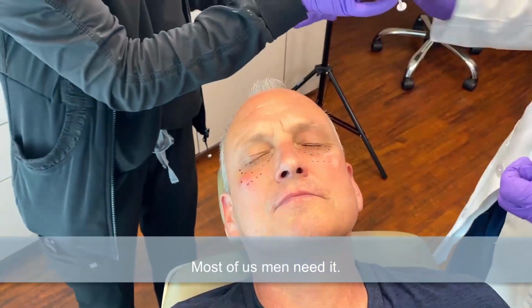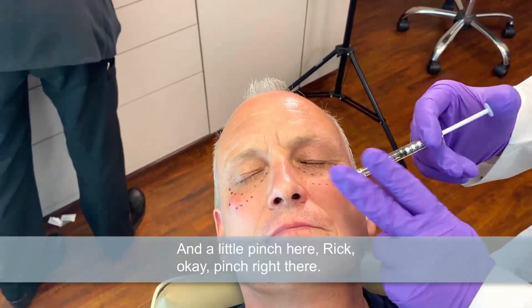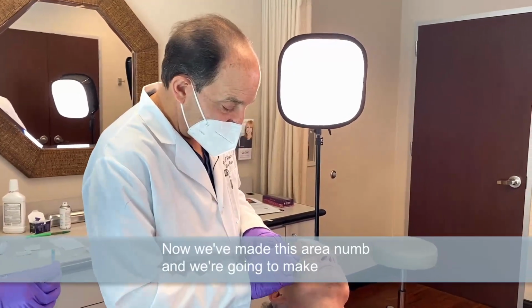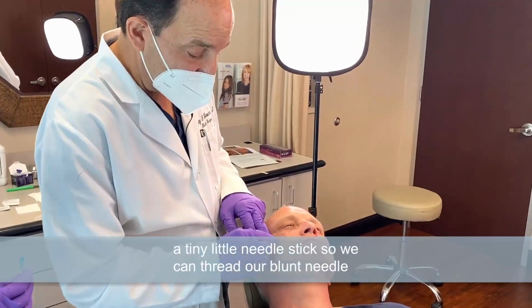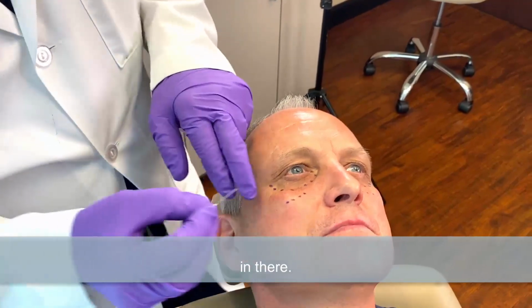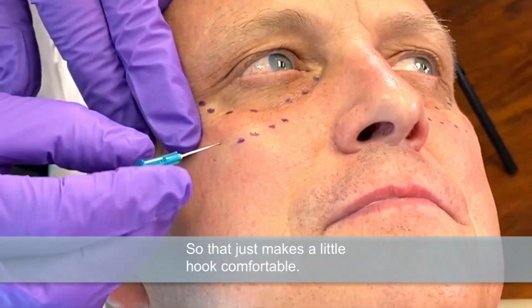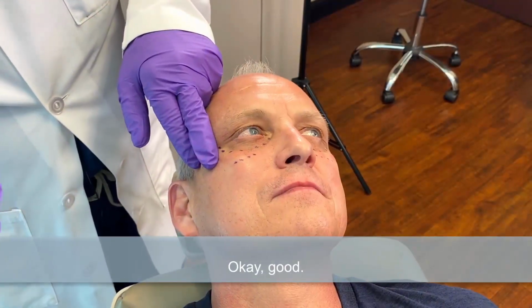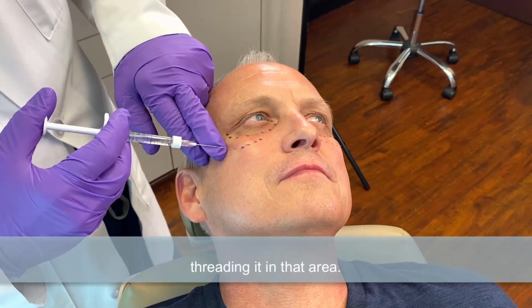Great, thank you. And a little pinch here, Rick, okay? Pinch right there. Okay, we're cleaning up again. Now we've made this area numb, and we're going to make a tiny little needle stick so we can thread our blunt needle in there. And you shouldn't have any discomfort here. A little pinch there. So that just makes our little pilot hole comfortable. Okay, good. And now we'll take this blunt needle and we will start threading it in that area.